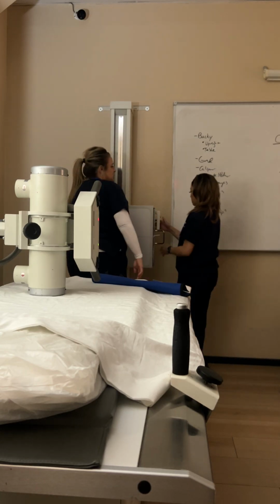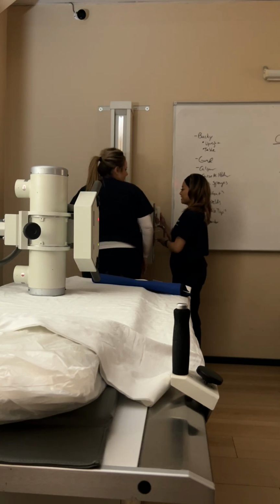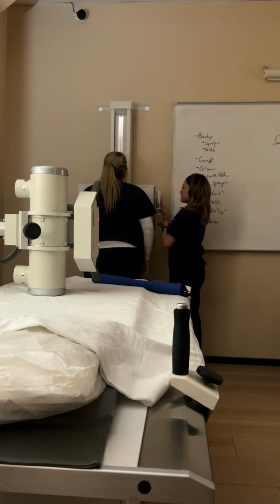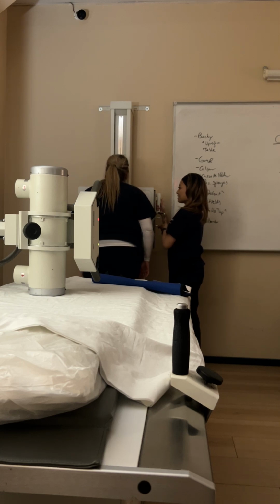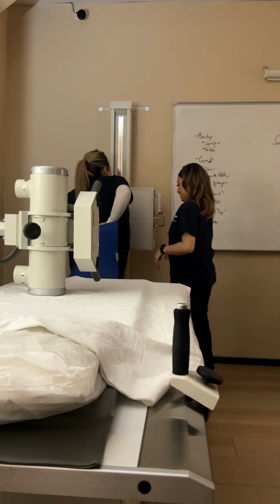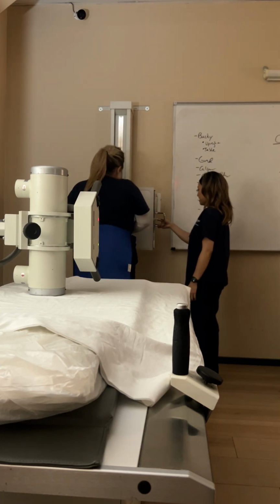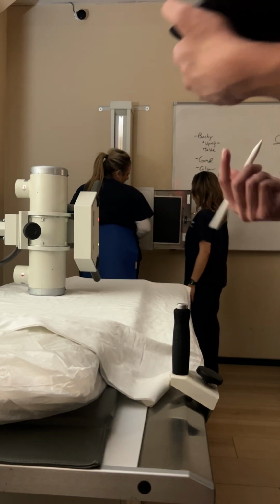Questions on that? You will find that there will be some exams where you will maybe set up more once the patient's in, but always try to do as much of the lining up and setting up as you can before the patient comes. Because if I'm a patient, I'm already nervous. There's something about sensing professionalism that comes with having so much of this ready to go, so that all I have to do is say, great, so what brings you in today?